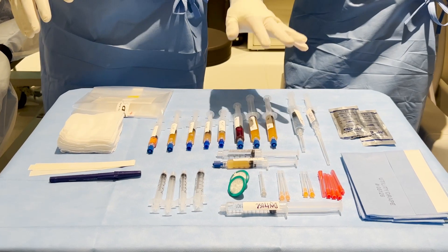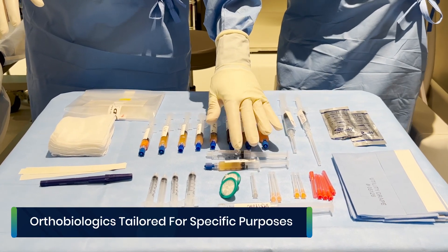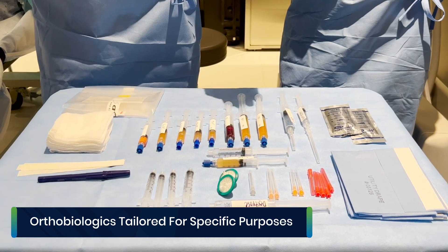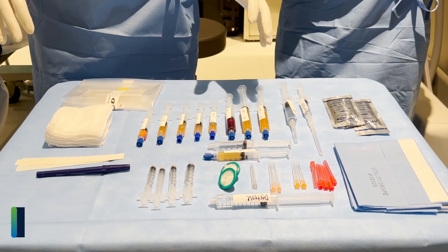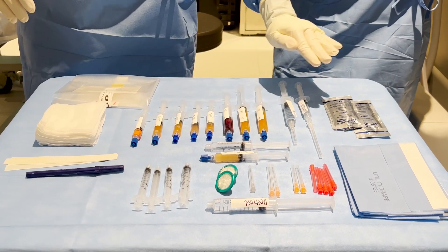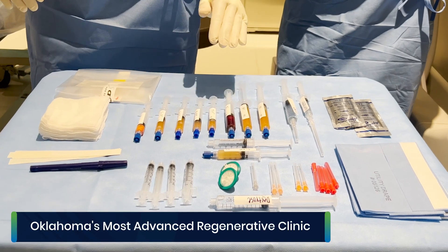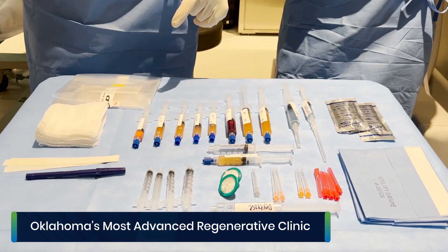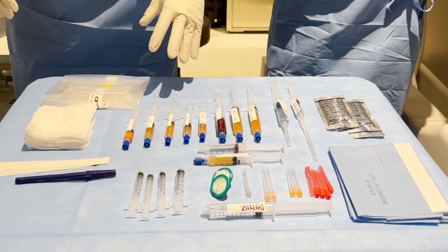We actually have eight orthobiologics because our 5X PLM is up here. That gives you an idea of the range of what we can do — you would need eight different machines to make this, and even then it wouldn't be of this quality. That's the point about what we can do in terms of quality here in our lab.